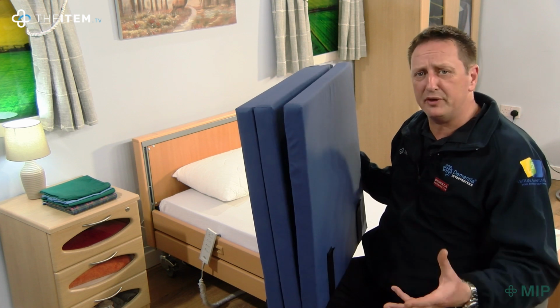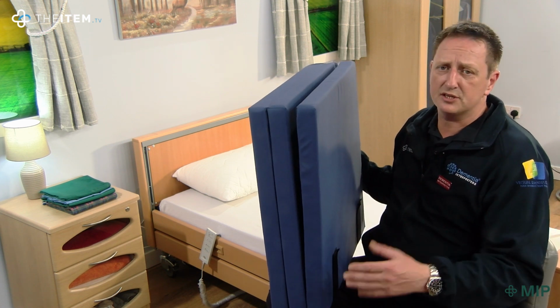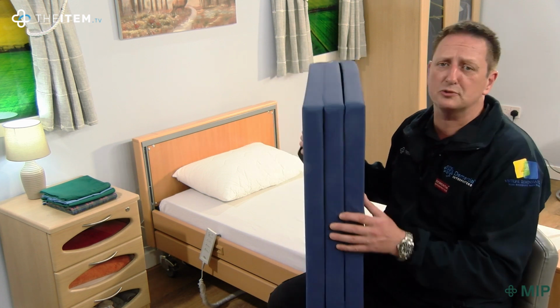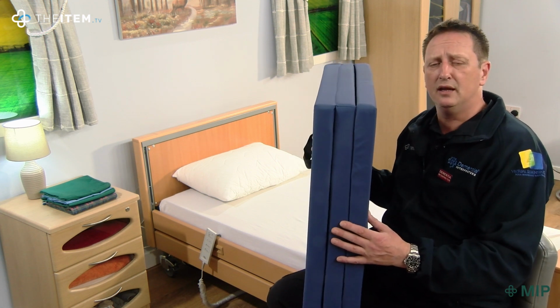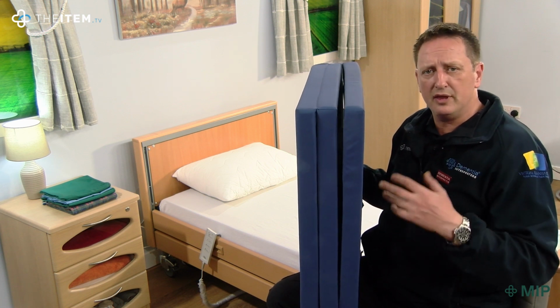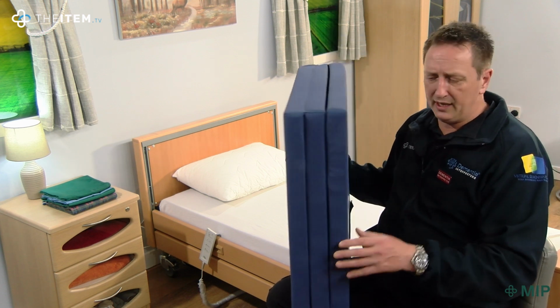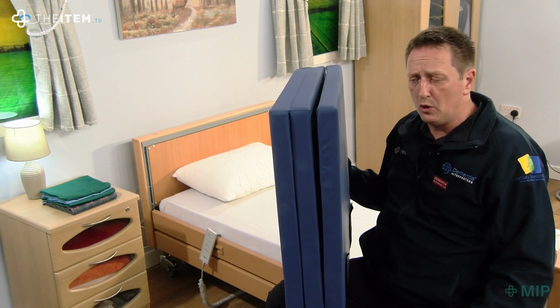Disorientation in bed is very common, and if there's bad lighting in that room, there is a risk of falls. So this is here as a protection. It may be the last resort. It may be something that you never thought about doing. But remember, if you pre-plan, then we can reduce those injuries that could hospitalise your loved one. Really, really important in an NHS trust, in a care home, nursing home, or at home.